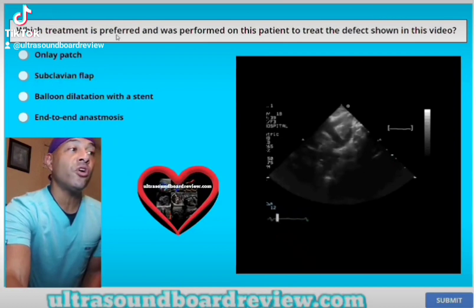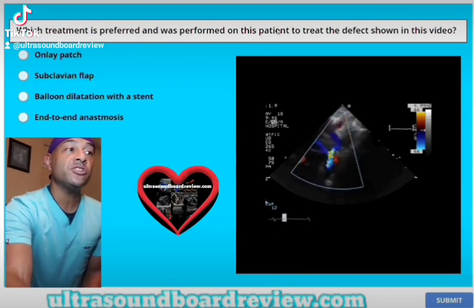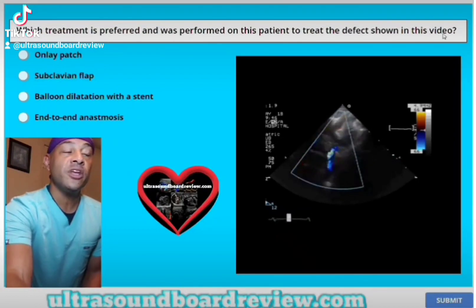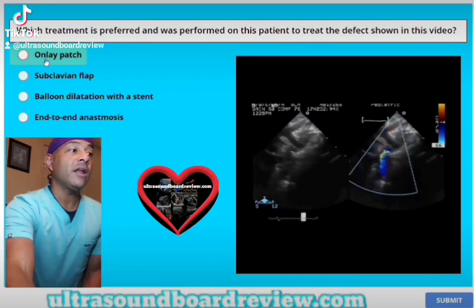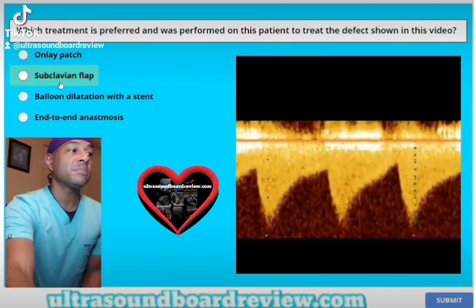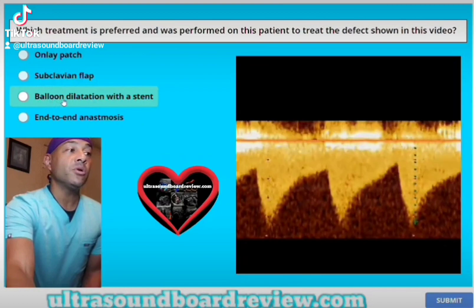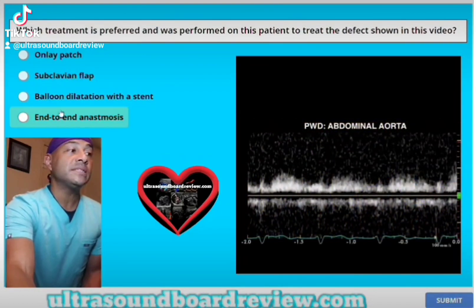Which treatment is preferred and was performed on this patient to treat the defect shown in this video? A. An onlay patch? B. Subclavian flap? C. Balloon dilatation with stent? Or is it D. End-to-end anastomosis?